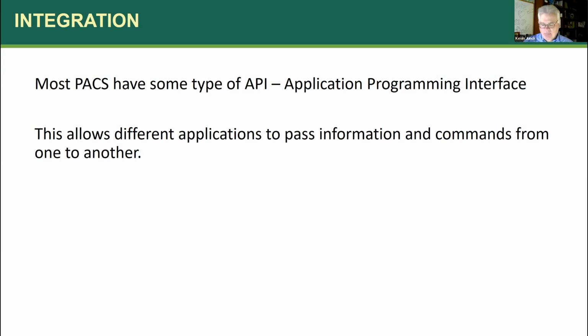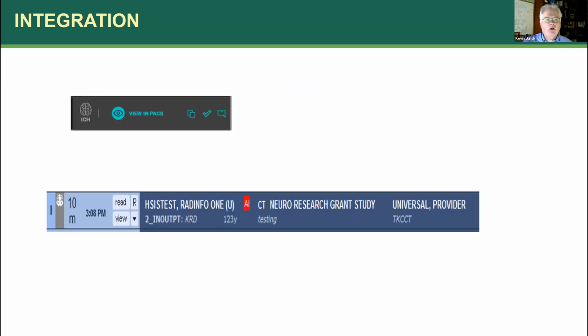Between the PACS and the voice recognition system, what have you, because that's where the benefit really comes in, when I can feed this into my normal workflow. One of the big successes that we had with this particular AI algorithm was that at the outset, they didn't really have the software available to tie this into PACS. Eventually they got it, and that really helped the workflow along.